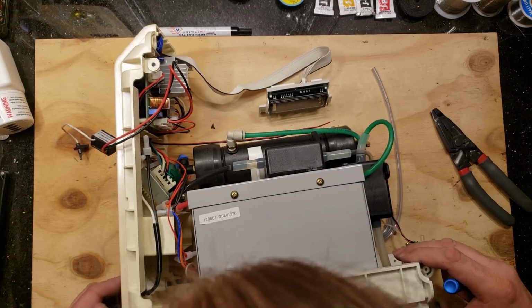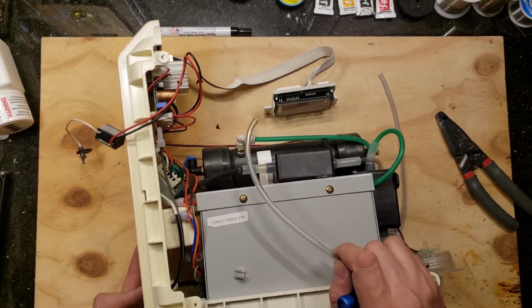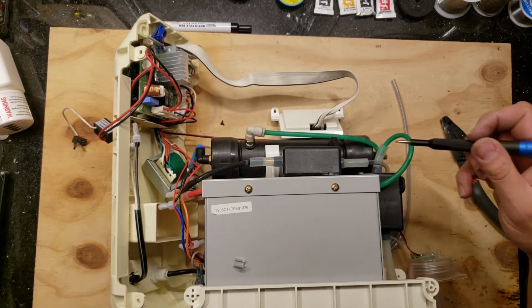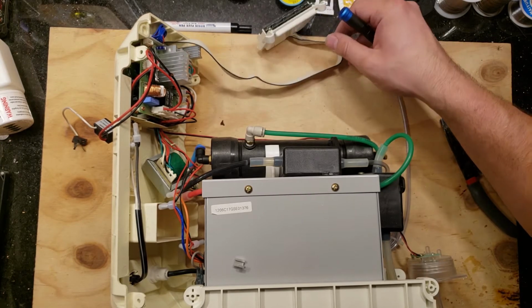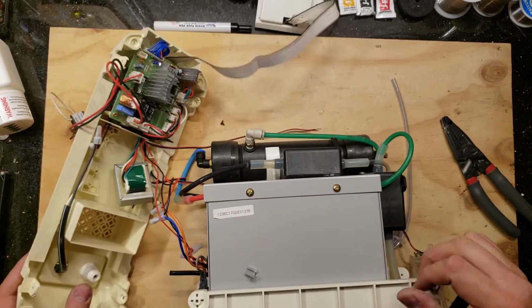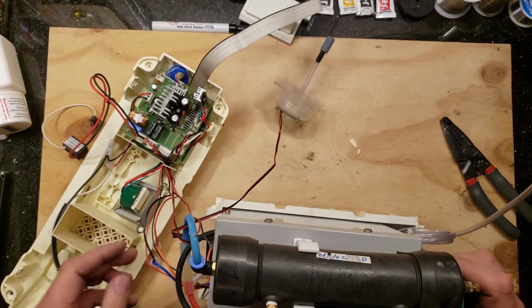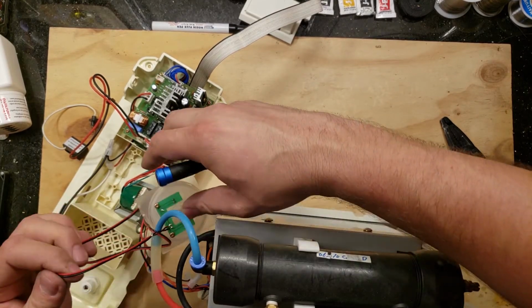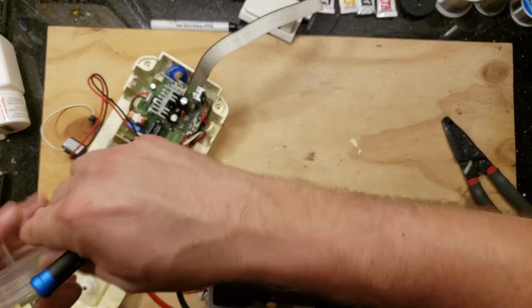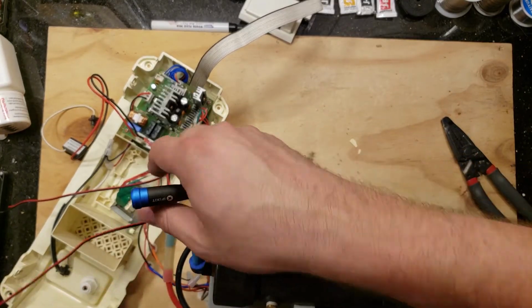Okay, so I'm assuming this port right here is the reject of air that's depleted of oxygen, because this is probably a membrane. So let's see. Or it could be the input. Maybe they were cheating when the membrane didn't work.